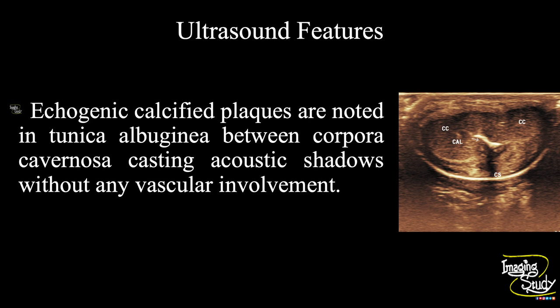In summary, echogenic calcified plaques are noted within the tunica albuginea between the two corpora cavernosa, casting acoustic shadows without any vascular involvement, suggesting a case of Peyronie's disease.